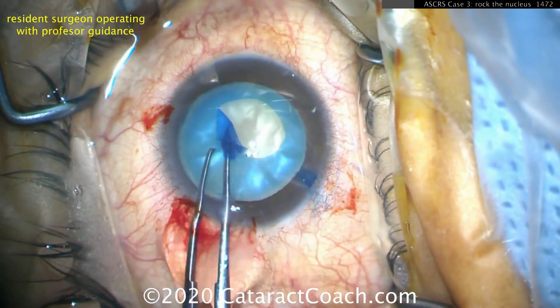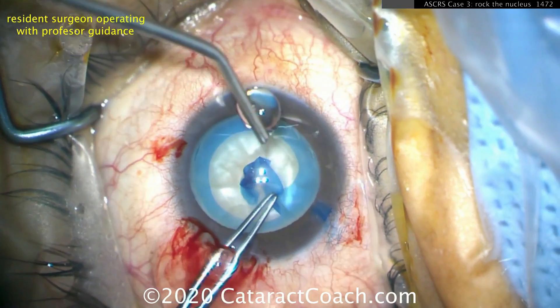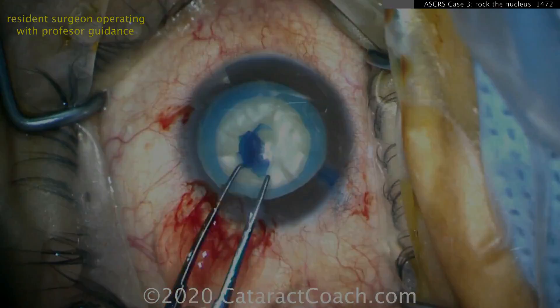This is a resident who's doing this, and you can see a really nice-looking rhexis despite having an intumescent liquefied cataract. So that's the needle decompression technique.